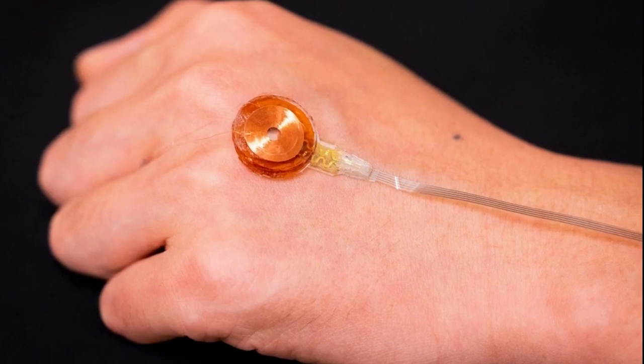And the latest tissue stiffness measuring technology based on sensing can only measure to superficial depths of upper skin, up to micrometer scale. To address the issue, the research team designed a simple miniature electromechanical device for high precision real-time evaluations of deep tissue stiffness.